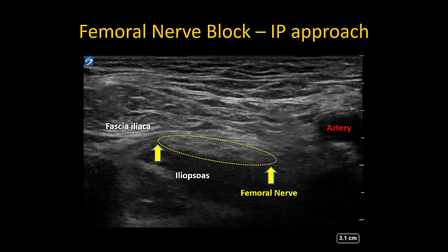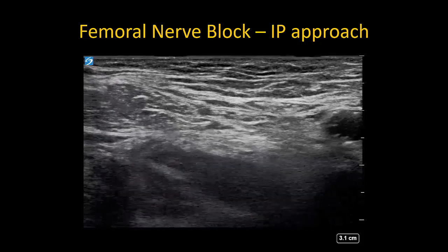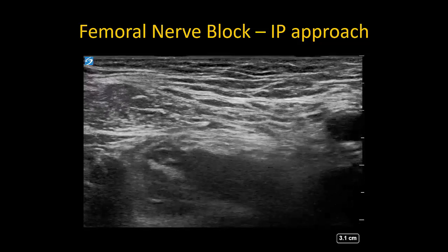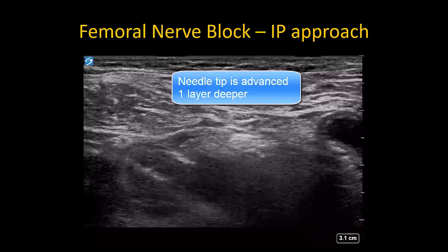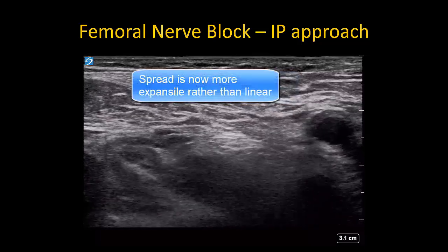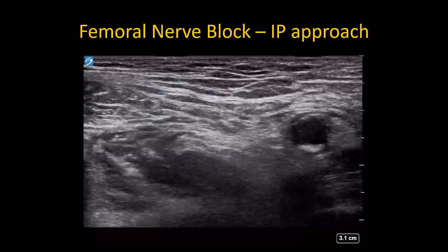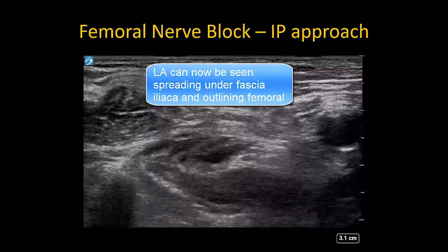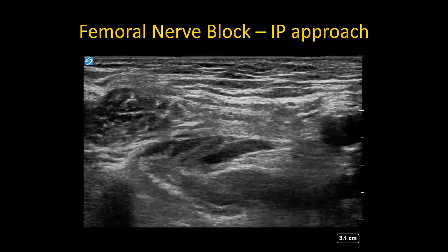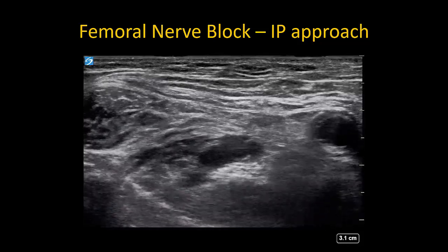Here is an in-plane example of a femoral nerve block. The nerve boundaries are shown under fascia iliaca. The needle is inserted from lateral to medial to pierce fascia iliaca at the lateral corner of the nerve. A test injection shows a linear spread pattern, and the needle is thus advanced slightly deeper. Now the spread is more expansile, signifying it is within the correct fascial compartment. Once this is seen, inject the full volume while scanning slightly cranial and caudal to confirm spread around the nerve. I do not usually reposition the needle and instead rely on the fact that effective spread around the nerve will be directed by the paraneural sheath.